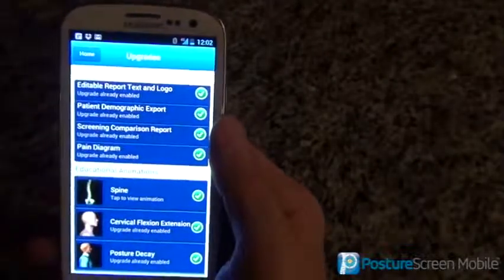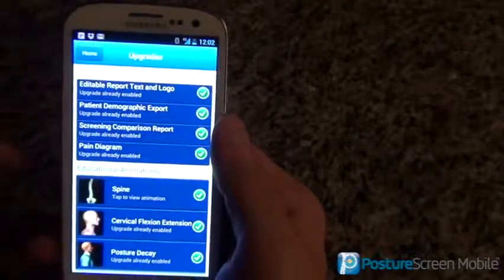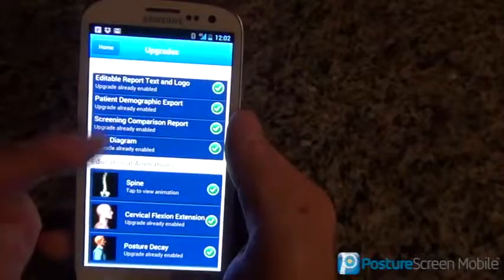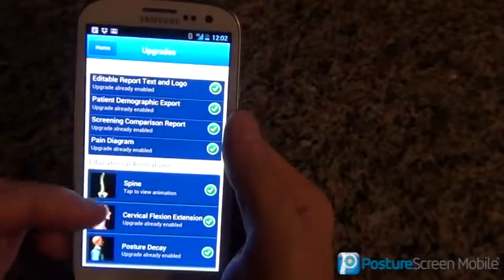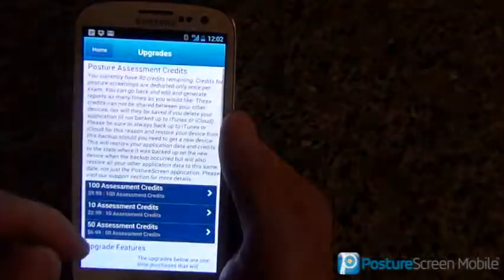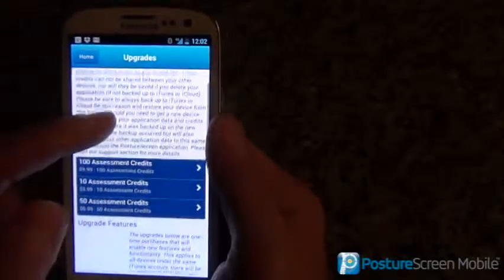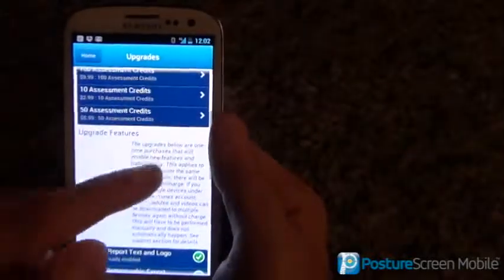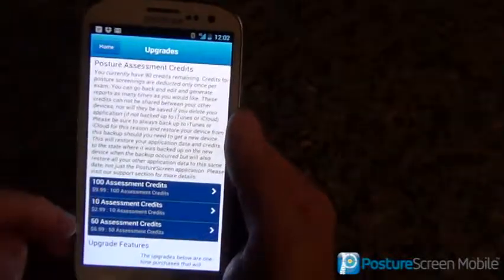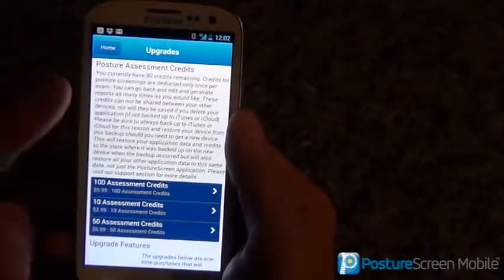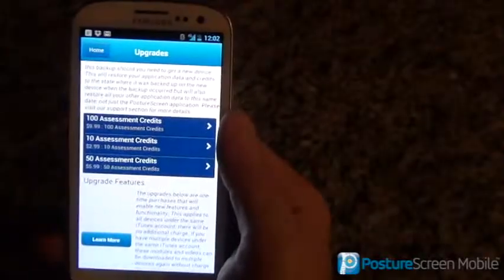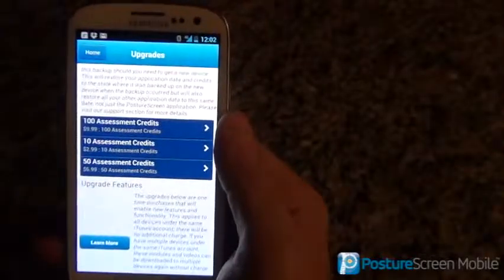It's a one-time purchase, so if you delete the app, this is tied to your account at Google. So if you have more than one device, you can go ahead and load that. Unfortunately, the credits are specific to the device, so you have to download the credits specific to each device.